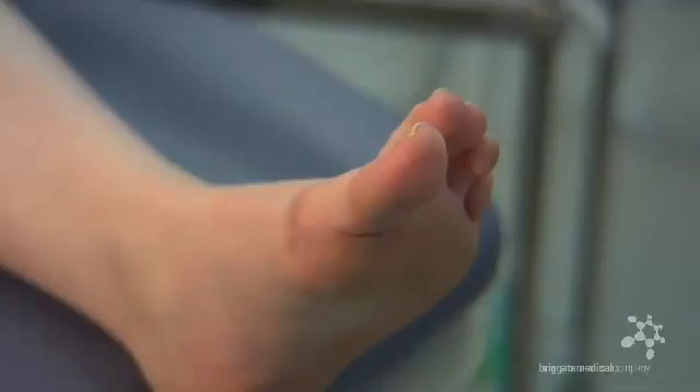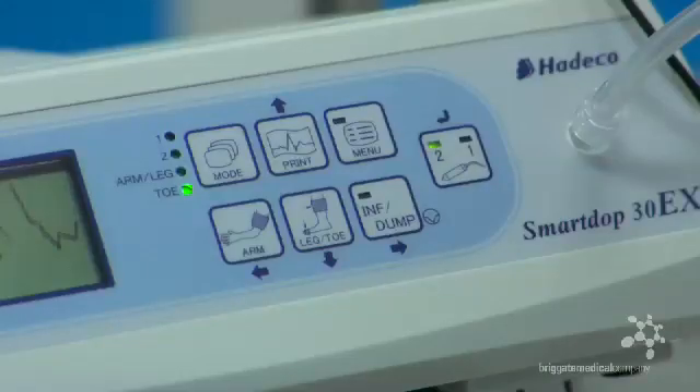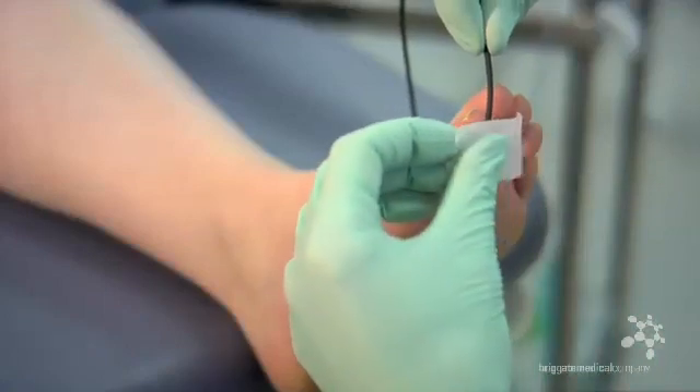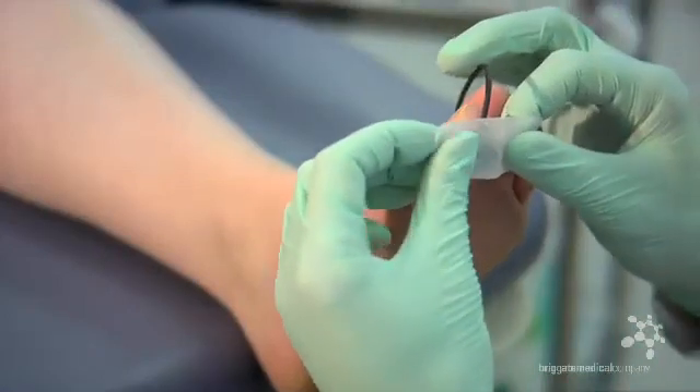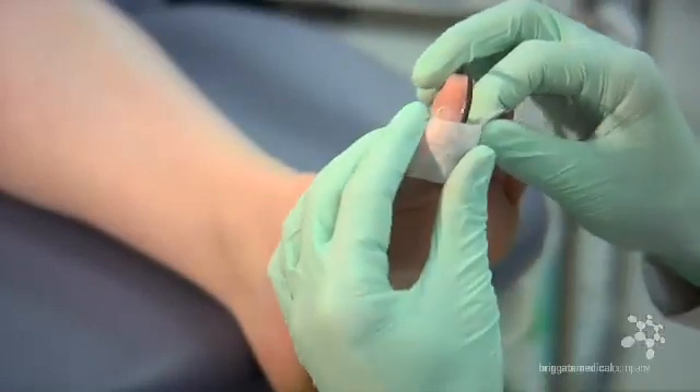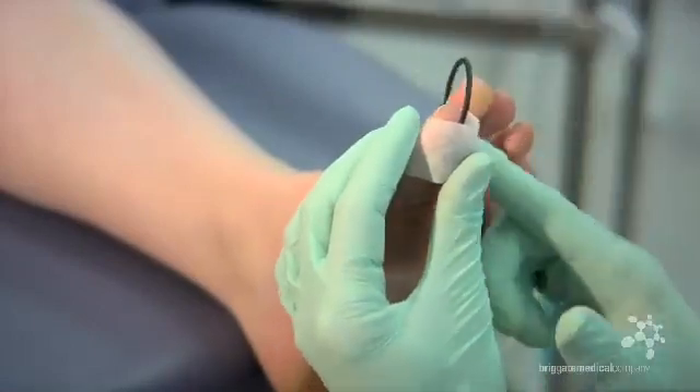Moving further down to the hallux or great toe, we need to change the Doppler to toe mode and ensure that it is reading from probe position number 2. This will be confirmed by the audible sound that you're hearing. The first tip here is to secure or seal the PPG probe onto the fleshy pad of the toe, with the wire coming straight out of the distal end of the toe, ensuring that the complete screen of the probe is in contact with the skin.